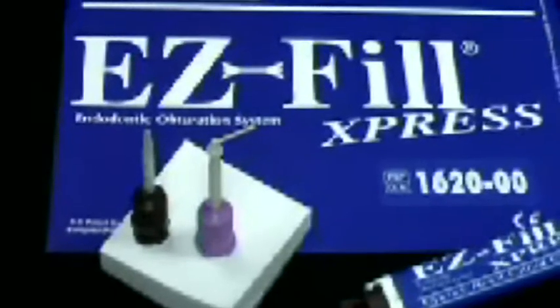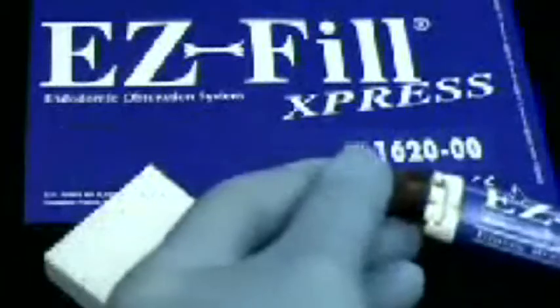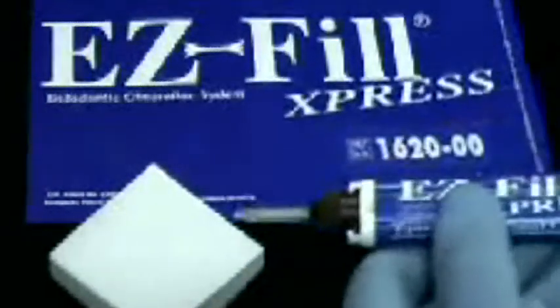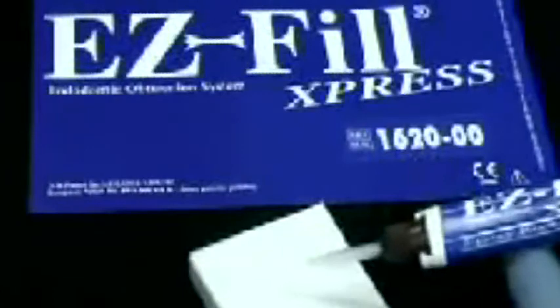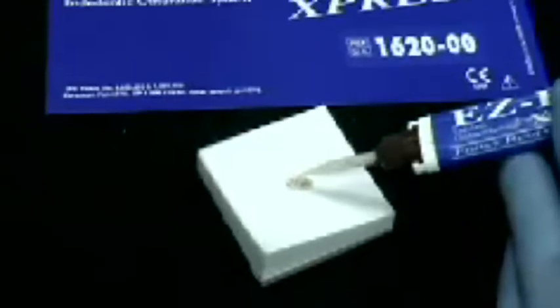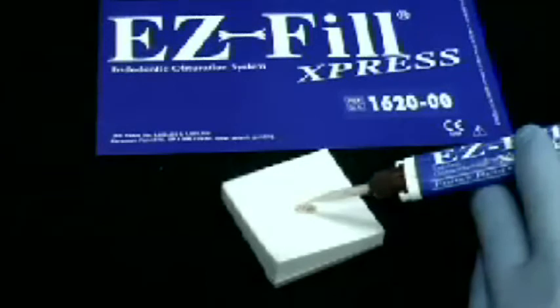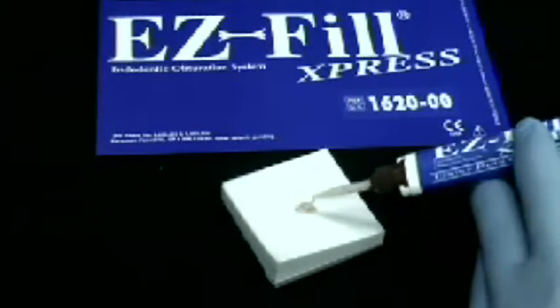Hopefully, by the time you see this video, EasyFill will have switched tips. Just place it on the syringe, and then you can express the material through the pre-mix auto-mix tip, and it mixes up the material for you. The beauty of this — you do not have to worry about taking the tip off right away, because this material takes a couple of hours to set up in this auto-mix tip. So you can mix up just the amount that you want, place it in the tooth, set the syringe aside, and if you need a little bit more, just express a little more out onto the pad as we see here.